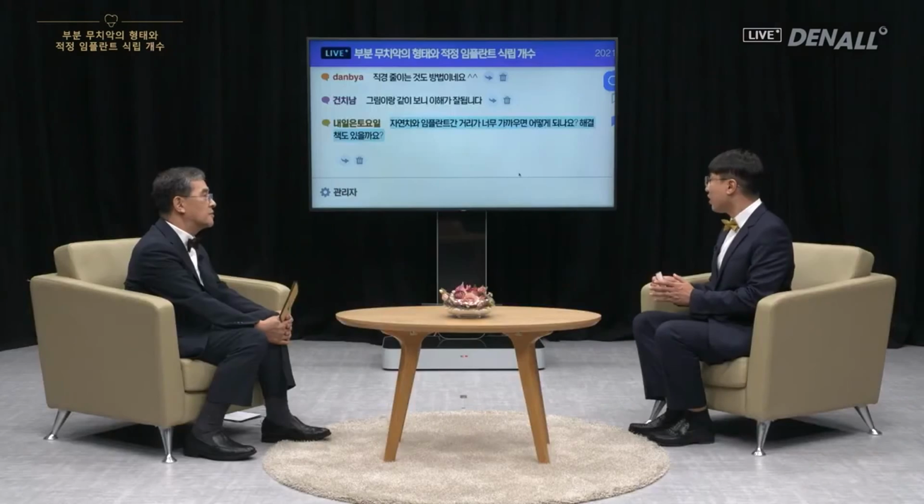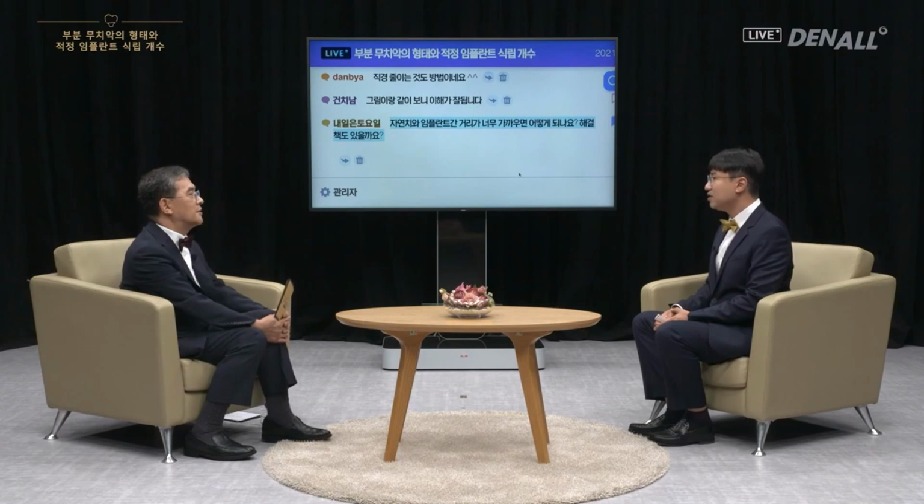I believe there is limitation in 2-piece abutment, and if you want to secure more space, I prefer rigid abutment, 1-piece abutment, or solid abutment.